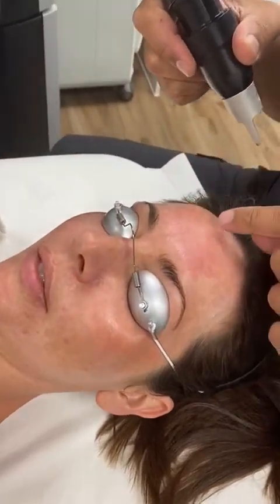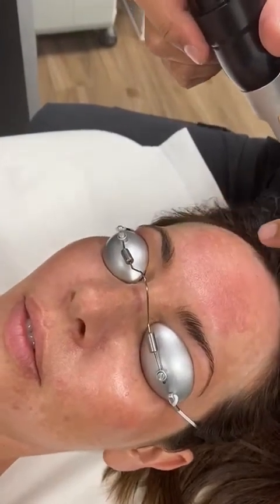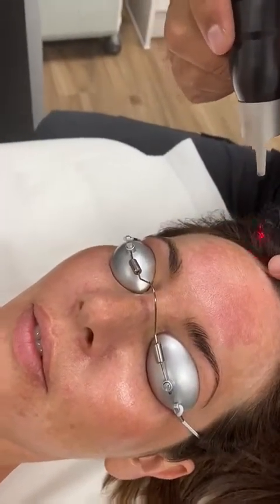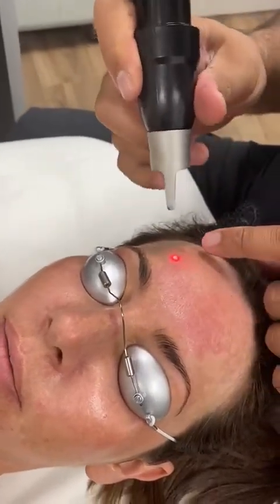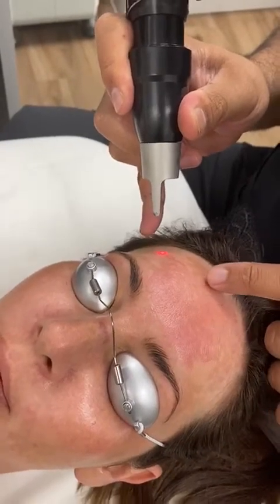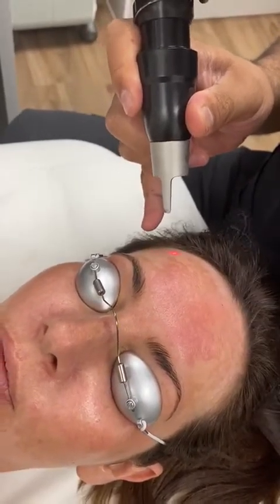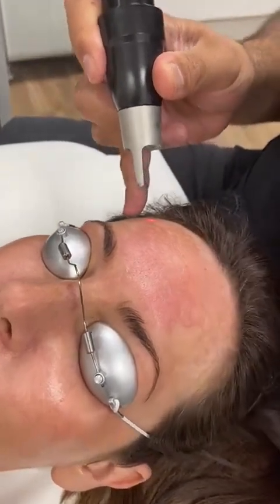This is quite a superficial melasma as well, because you can see it's really nicely demarcated and the edge is very, very visible. You'll be able to see slowly the area that I've just treated — the actual erythema will build up there and you'll be able to see where we've actually treated. That's actually manifesting right now, and you can also see it just gets slightly raised as well.